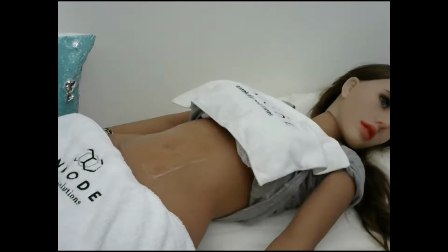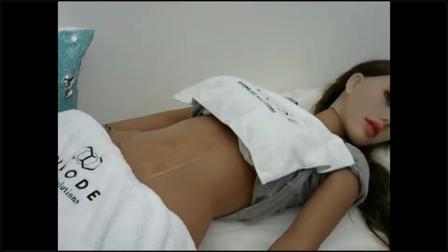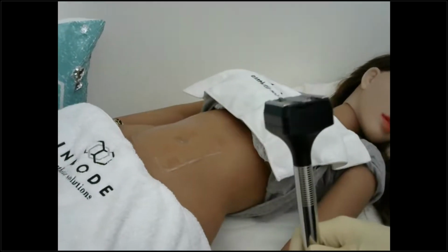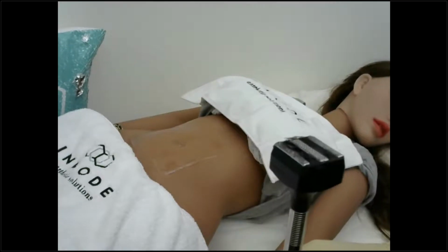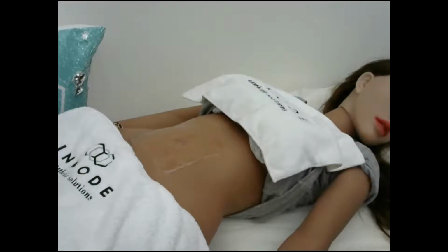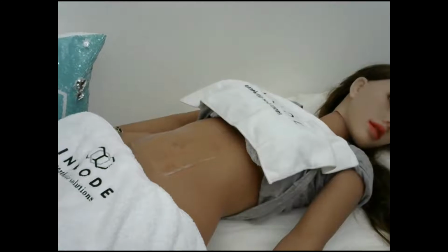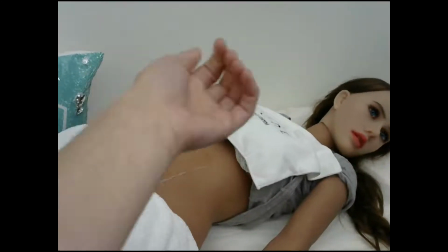And let's listen to the sound, the back coupling sound. Okay, so if I'm switching to ready mode on the screen and pressing the pedal, what I get is that sound. Alternatively, if I actually apply it to skin, I would get a different sound. And it will sound like this. I will try and demonstrate.